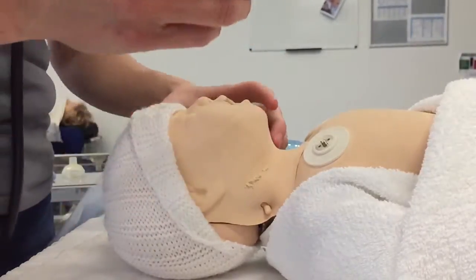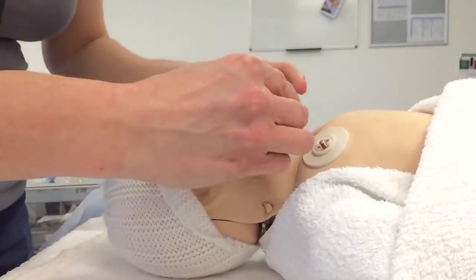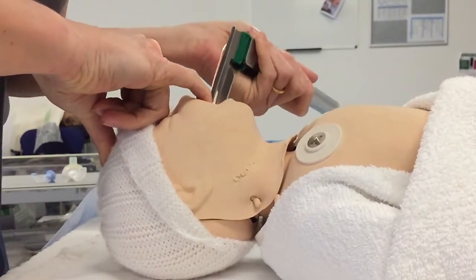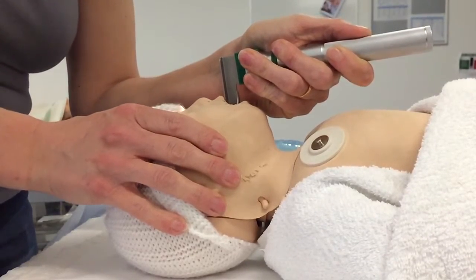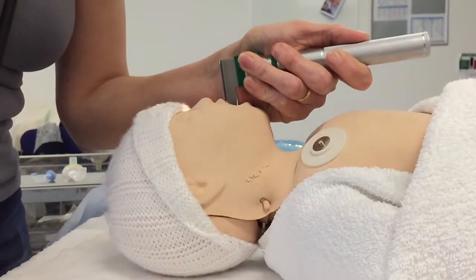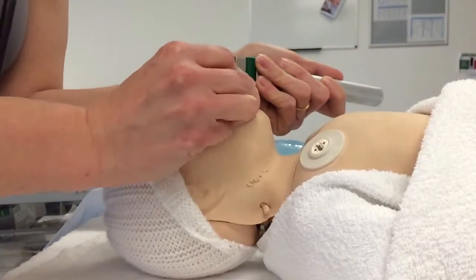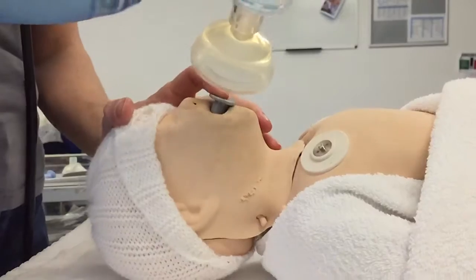I'm going to measure the Guedel airway first, from the centre of the baby's chin round to the angle of the jaw — I think that's the right one. I'm going to take my laryngoscope in my left hand, protect the baby's lip and gum, and slide the laryngoscope blade in to move the tongue out of the way so I can see down into the baby's airway. Can I see any obstruction? Yes. I'll place the paediatric Yankauer sucker at the level of the obstruction and suction only on the way out for a maximum of two seconds to remove it. With the laryngoscope blade still in, I'm going to insert my oropharyngeal airway, sliding it in along the line of the anatomy, and remove the laryngoscope blade as it goes in. Then I will give five further inflation breaths to this baby.